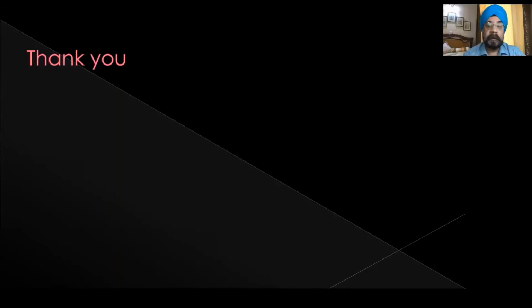Okay, so the question is: do you attach ECG on all patients when you do an echocardiogram? This is a broad question. I would say that yes, we do, but not in the current COVID situation, when you have ASE guidelines that you may not use ECG because you are unnecessarily making contact by making an ECG. So ECG can be given away in the current situation, but otherwise you need to put ECG leads on every patient. You've got to record blood pressure of every patient whenever you're doing an echo. That's something critical.